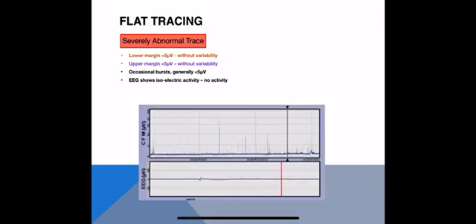This is a flat trace — again severely abnormal. Both the upper and lower margins are less than 5 and there is no variability in the trace. There are occasional bursts but the majority are less than 5 microvolts. The raw EEG is also almost completely flat with no activity.